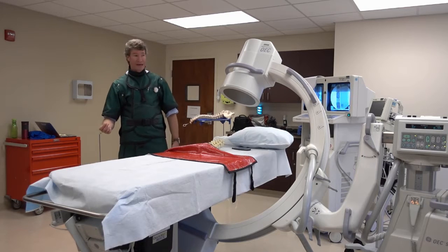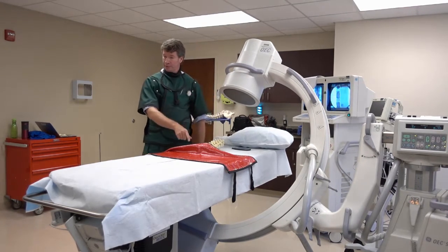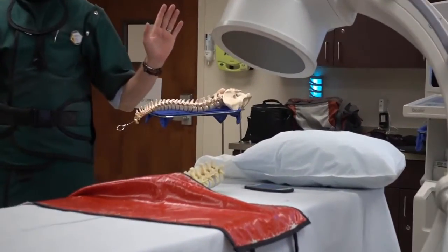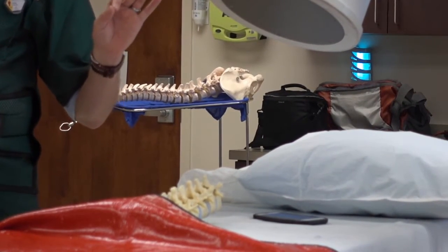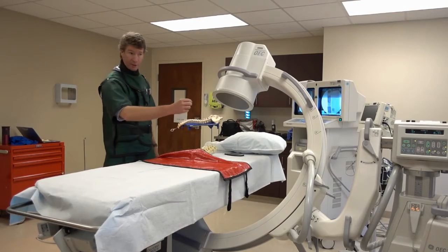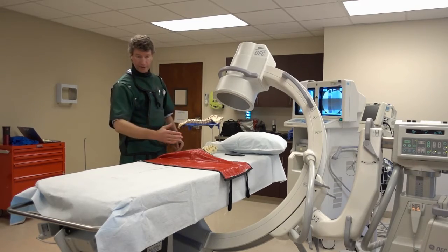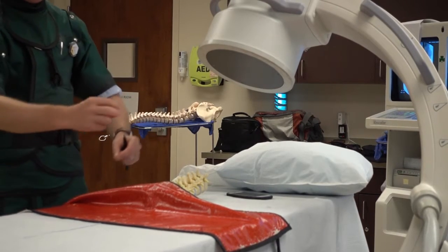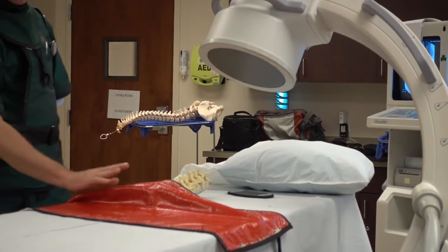Why it's important is that a lot of doctors will numb the skin, put the needle down, step away, put the needle down, step away. That's a lot of steps. Nothing wrong with that. But what happens is you're not using lidocaine. What I happen to like to do, what Dr. Will likes to do, is when we're using lidocaine as we advance the needle, I'll do a one-handed advance and I'll have a long needle on there or even a little tubing that allows me to put my hand over here and advance and steer the needle very quickly without much exposure to my hand. So that's why we use the drape.